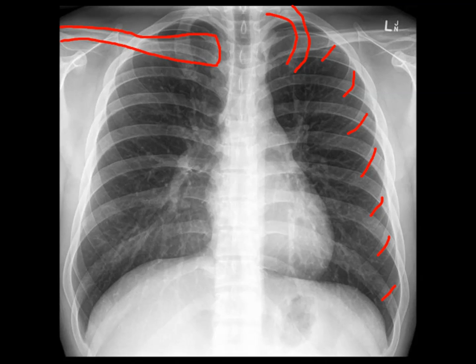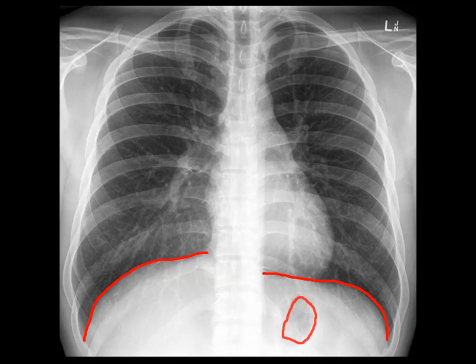The next bit outlined is the right clavicle. The borders of the diaphragm are outlined here. Notice that the right hemidiaphragm is higher than the left — this is normal and is due to the liver lying underneath. On the left side, you might see a bubble under the diaphragm. This is a gastric bubble in the stomach and is a normal finding.